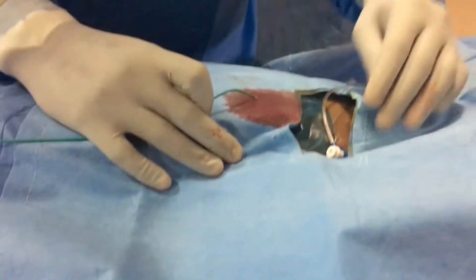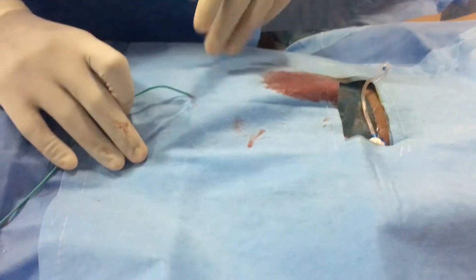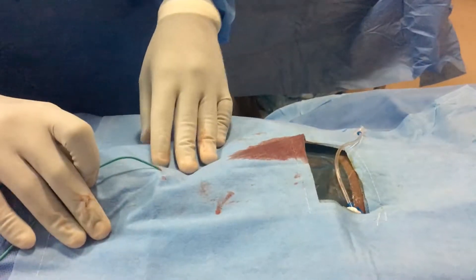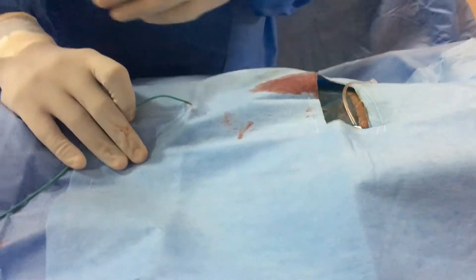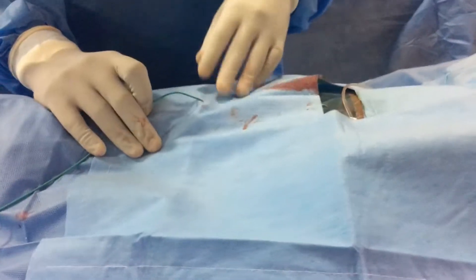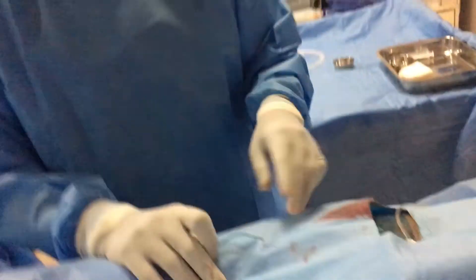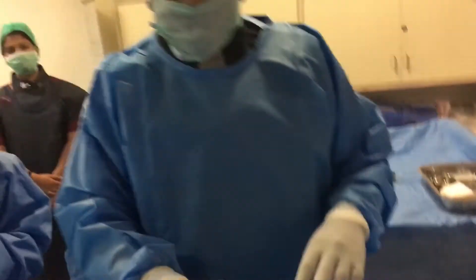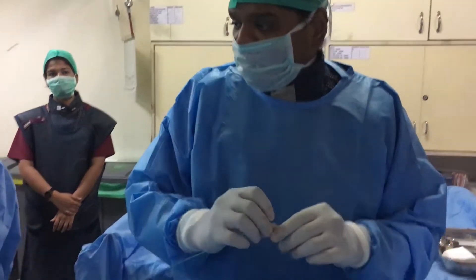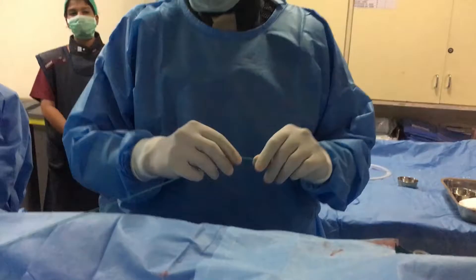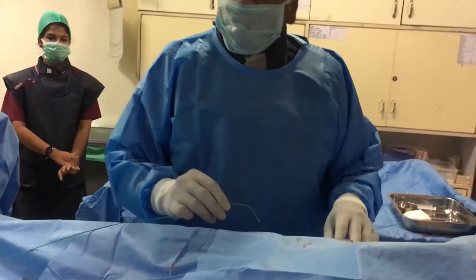So I have taken a right groin access with an 8 French femoral sheath because our Mullein sheath will be around 6 French. So I have taken an 8 French femoral sheath.